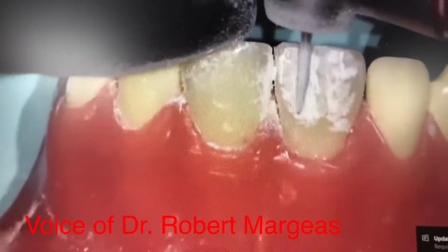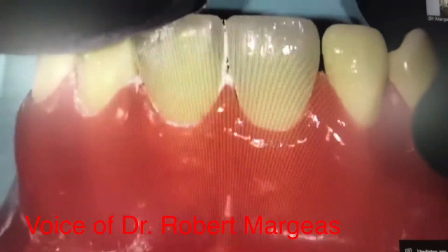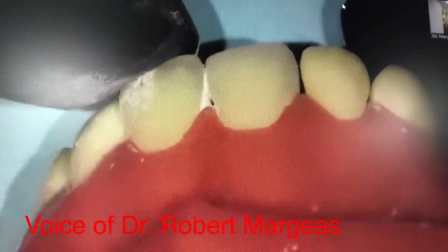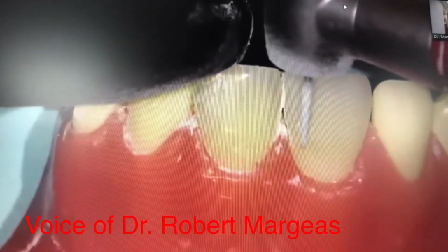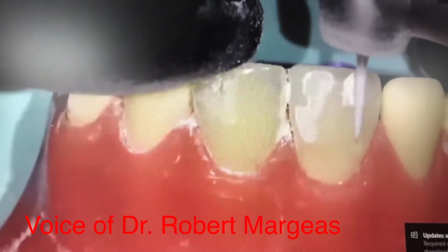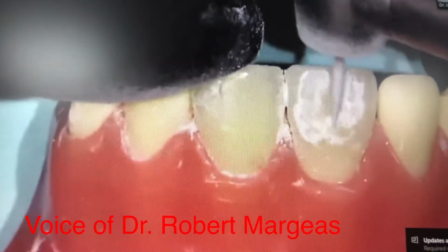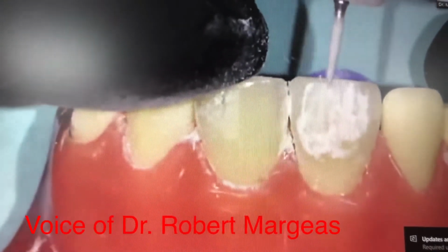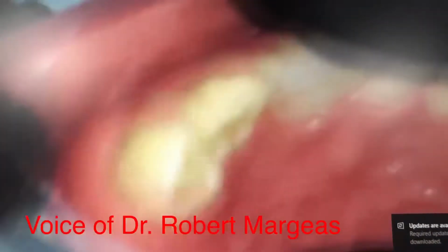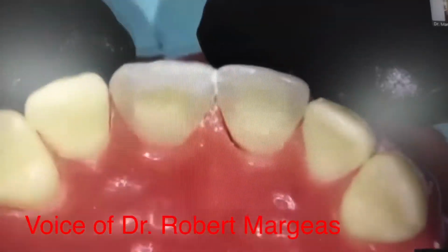This is somebody who has a lot of surface texture. Going back and forth with that diamond, and you'll start to see the texture. Okay? Once I have that texture where I want it like this, or the anatomy, I'll show you from the incisal edge. Let me show you from the incisal. The texture, the enamel, and you have like a little split lobe there.